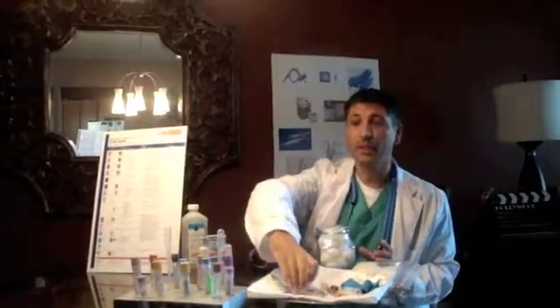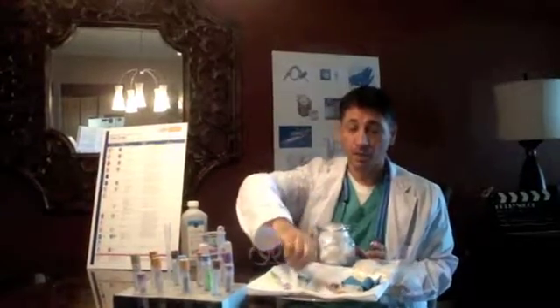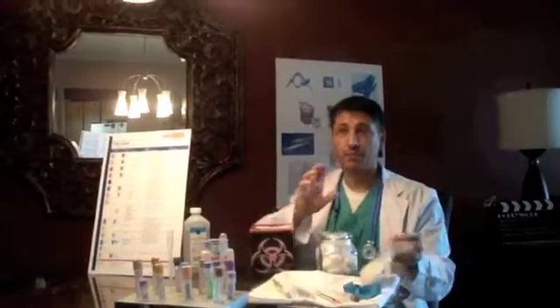Materials for a venipuncture procedure: safety needle, 22 gauge or less; butterfly needles, 21 gauge or less; syringes; blood collection tubes; tourniquet; antiseptic; individually packaged alcohol wipes; gauze or cotton balls; sharps disposal containers, OSHA-accepted, puncture-proof container; bandages or tape.